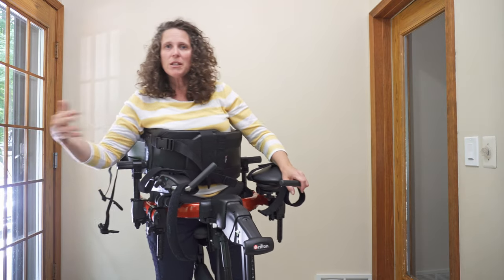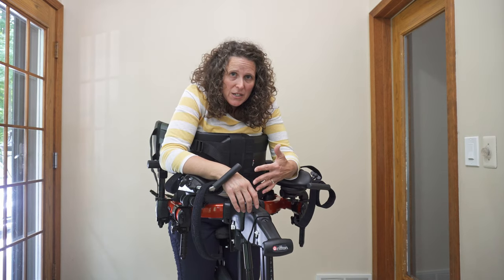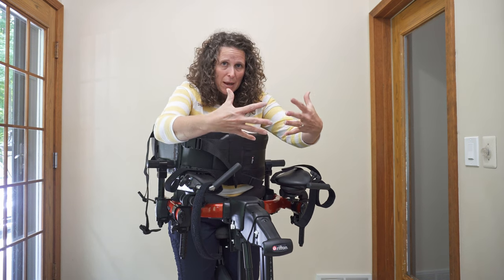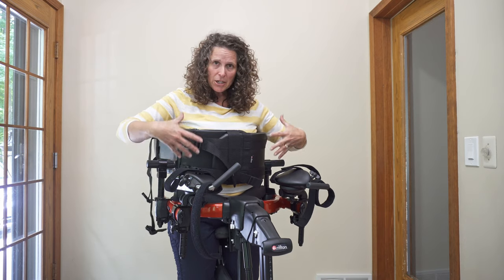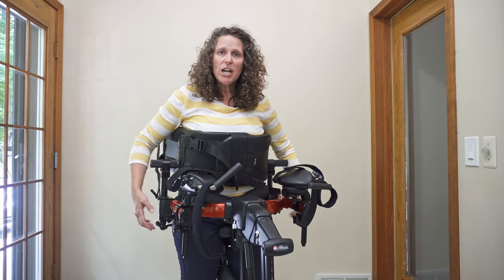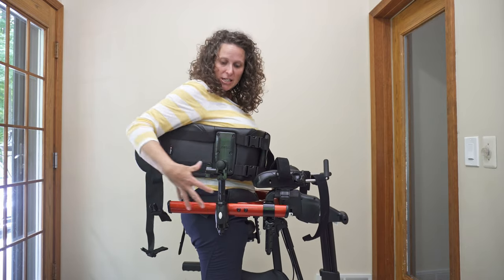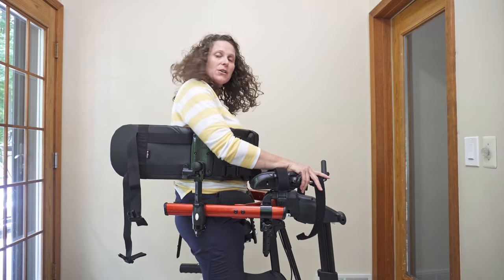Once you have that position figured out, you're still going to be in this position where you're dropped forward. What I would like you to do is to actually bring the chest prompt back — hips are good, the chest prompt needs to go back. You're going to need to change the position of the chest prompt on the frame and just slide it back.